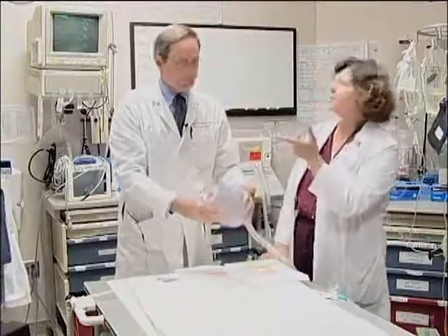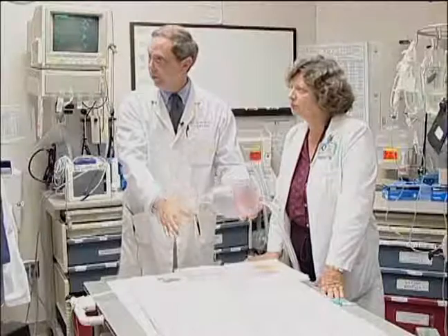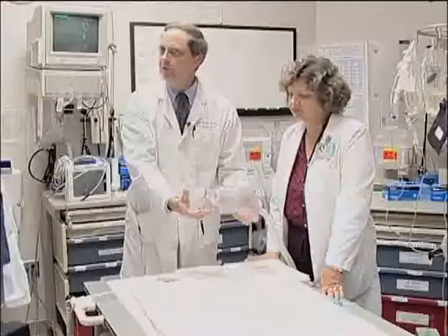And would that be them doing that? Yes. Ideally, it would be you, or it would be Doc 1 who is actually going to do this. And most of the time, it's probably respiratory therapy because Doc 1 is still getting everything ready. Remember, some of these bags have valves in them. So if you put the mask on the patient's face, they actually will not be getting oxygen flowing into the mask. Some of them do, some of them don't. So we want to actually give them just a little assist of oxygen as it goes.